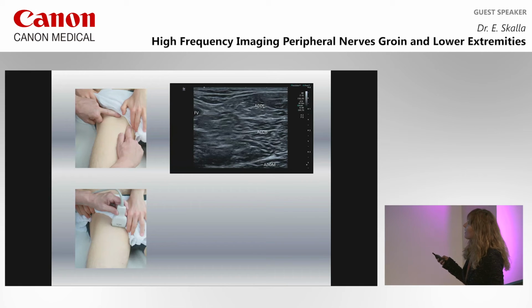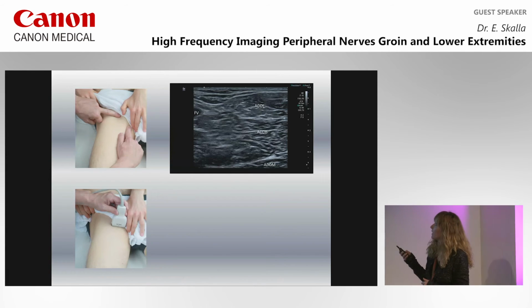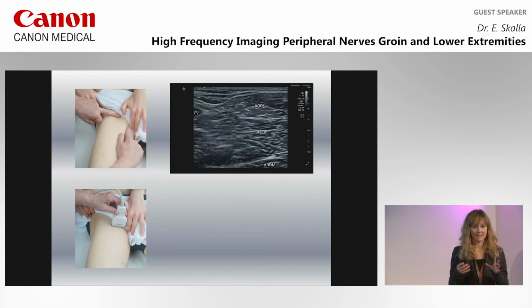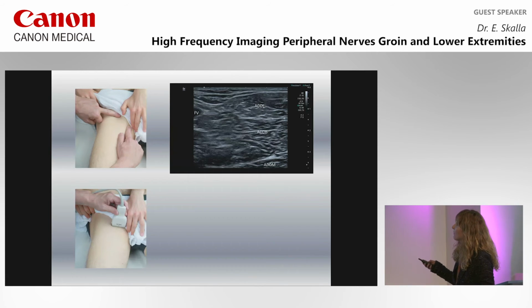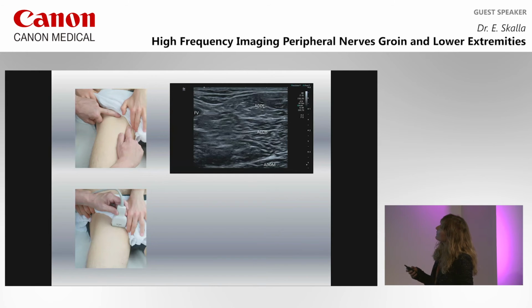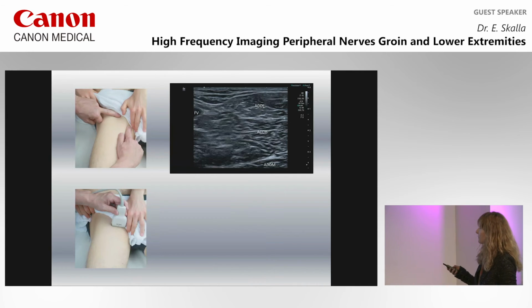Don't think that these are two muscles. The adductor brevis usually has this septum in the middle of it, but it's one muscle. So don't think it's just this one. Longus, brevis, magnus. This is what we have to have in mind. Here we see the femoral veins, and the regions where we have to search for the nerves are anterior and posterior to the adductor brevis muscle.